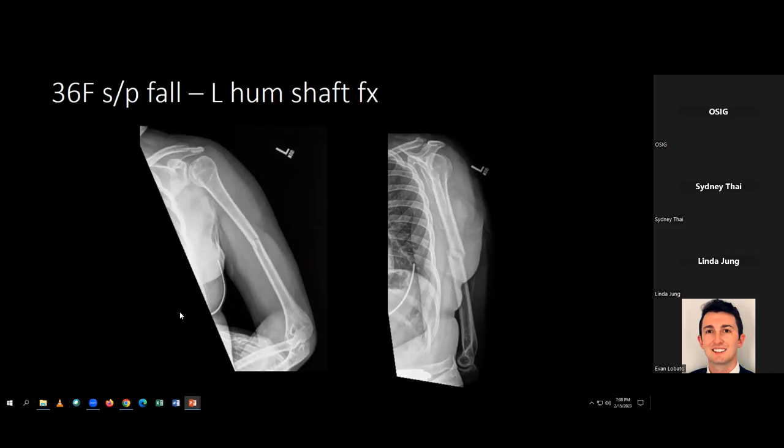Oh, okay. So some other things that you can look at on this X-ray, like obviously these are X-rays dedicated to the humerus. And I know that just because I can see the whole humerus bone, but other things that you want to look at when you get called for these types of injuries, they say someone has left arm deformity or left arm pain.